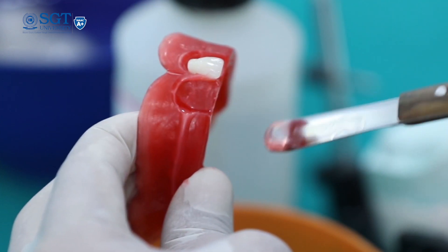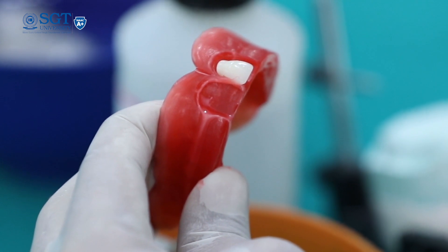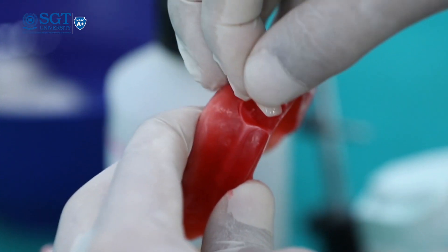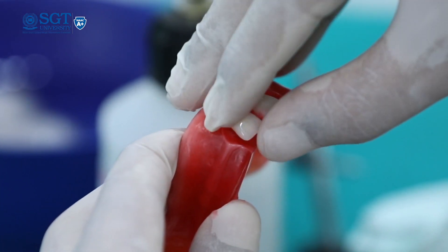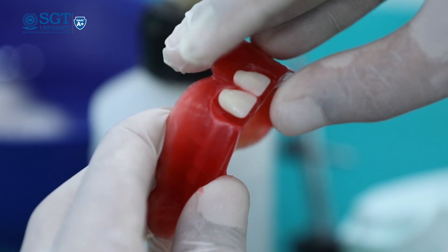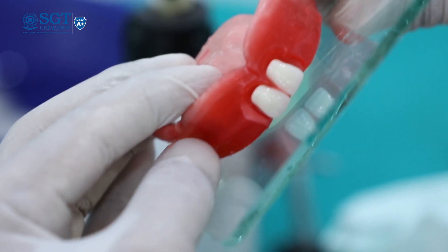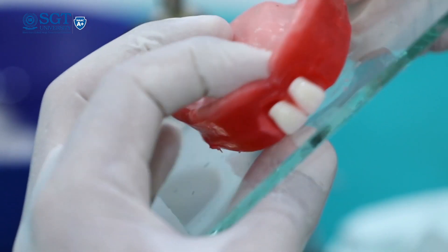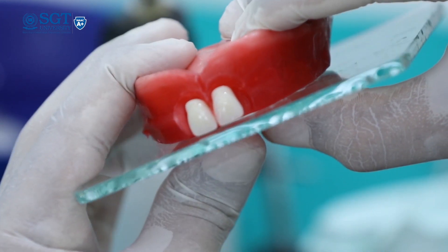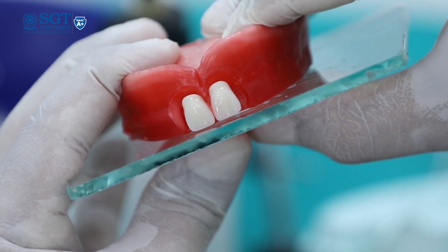In occlusal view, the incisal edge of the central incisor should follow the arch form. In a similar way, you will arrange the maxillary left side central incisor, keeping in mind the same principles — the incisor edge should touch the glass slab and the long axis of the central incisor is parallel to the midline.